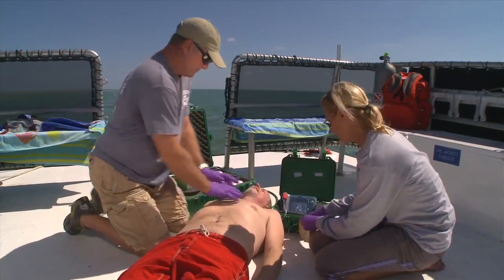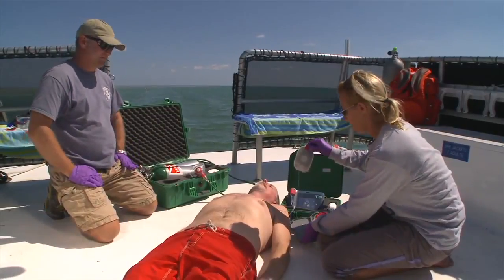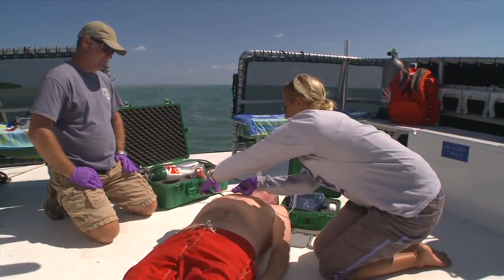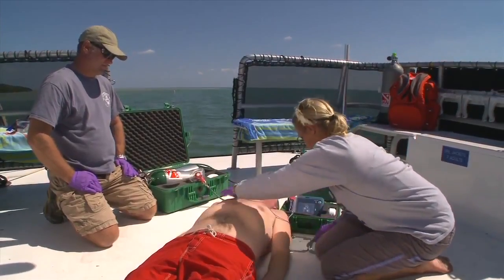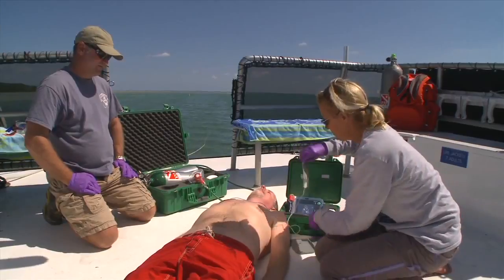If an AED is available and you verify the patient is not breathing, remove the patient from standing water. While you can use an AED around wet environments like a pool, a boat, or in the rain, you don't want to immerse the AED in water or spill liquid on it.